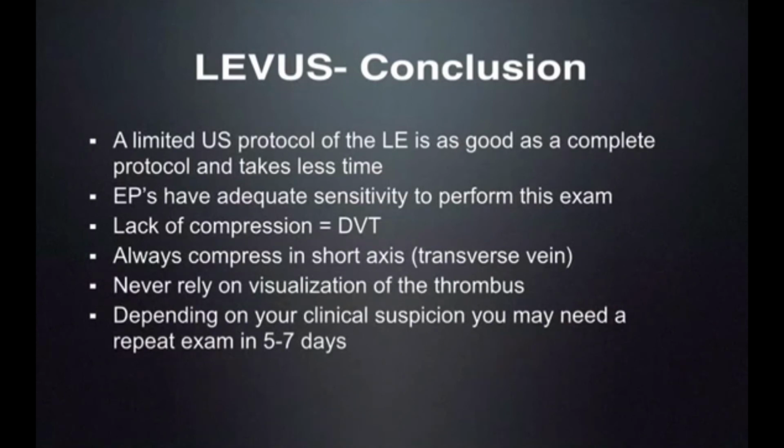Never rely on visualization of a thrombus. You might have a thrombus but not be able to see that hyperechoic material inside the lumen of the vein. And depending on your clinical suspicion, your patient may need a repeat exam in 5 to 7 days if they're a high or moderate risk population or they have a positive or no D-dimer.